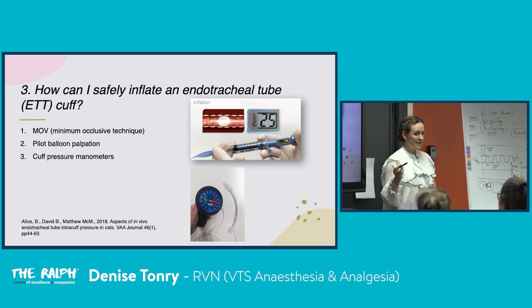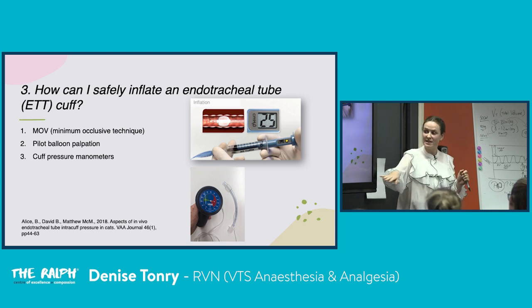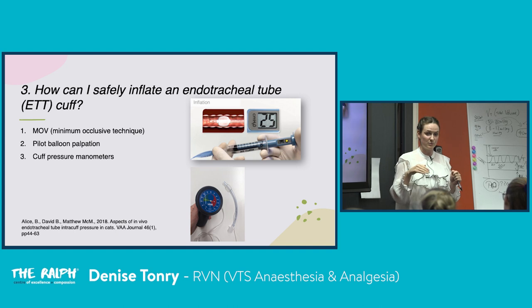When we mechanically or manually ventilate these patients, what are we going to be using? Certainly less than 20. We're going to be using 8, 10, 11, 12, something like this. If we go to the higher pressures and we've leak tested them using this method, we may find we get a leak for some reason. We decide we have to use high pressures for this patient, and then suddenly you may be like, oh, there's a bit of a leak in the system, which usually, again, it's mechanical ventilation and you see the leak.